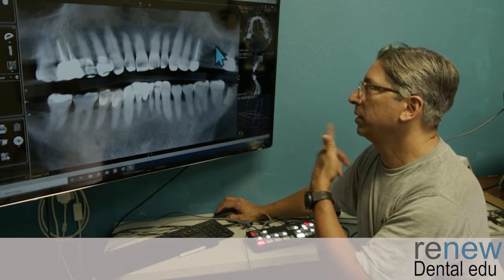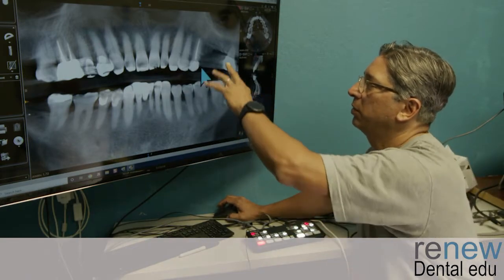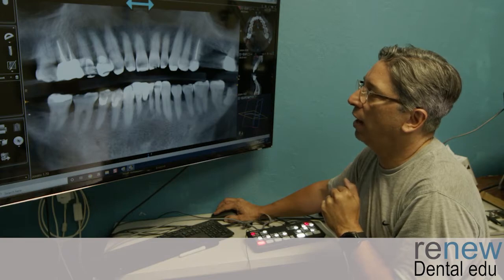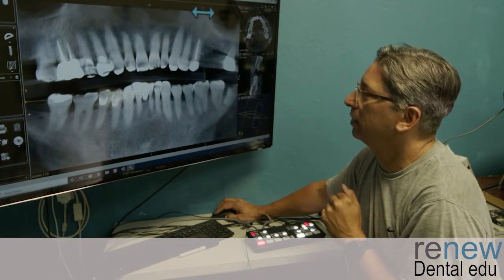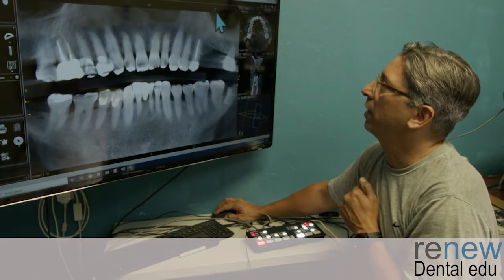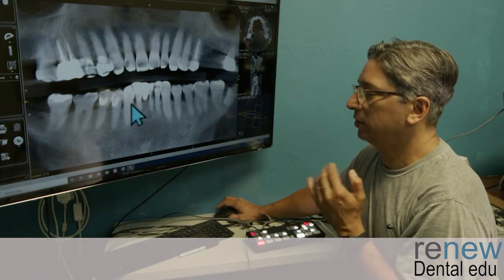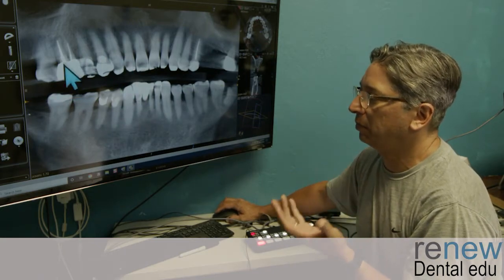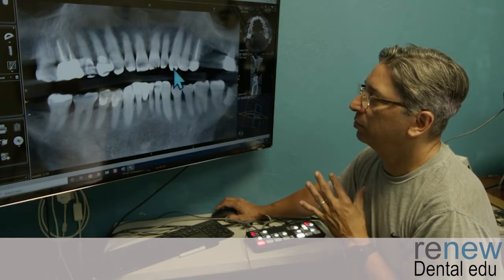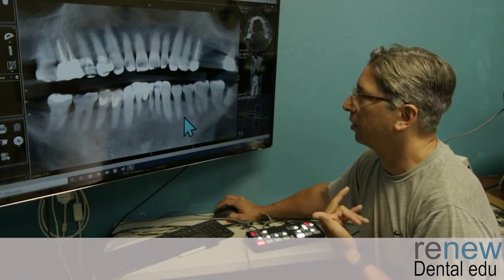So let's go up to this area here. This is an interesting one. And the reason why I want to talk about this one in particular is how good the bone looks and why didn't this patient actually get anything done. I suspect it's just purely a financial situation for the patient. And somehow the patient thinks that chewing on 50% of the mouth is okay because he's definitely not chewing over here and he's putting more load across here, but he's chewing most everything over here.